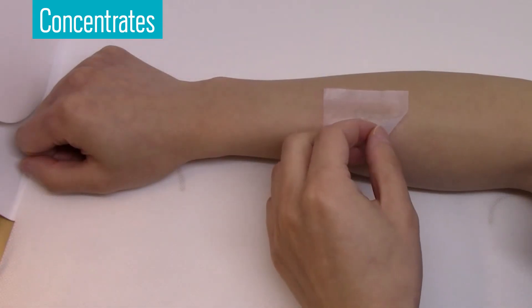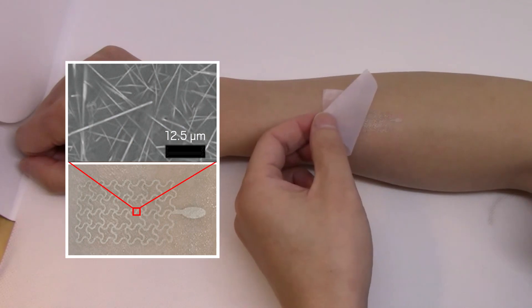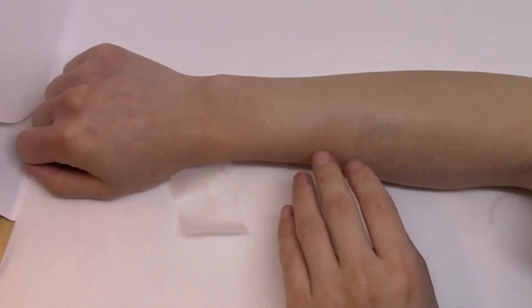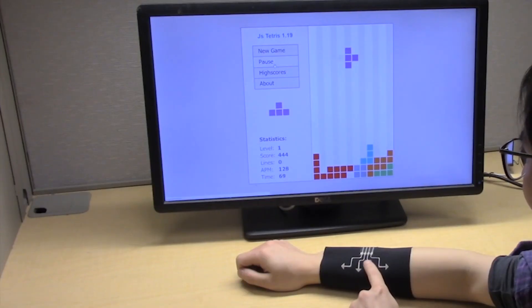This researcher looks like they're putting on a temporary tattoo, but they're actually applying an ultra-thin electrode. Laced with conductive silver nanowires, this ultra-thin electrode can be used to monitor heart signals or even play a game of Tetris.